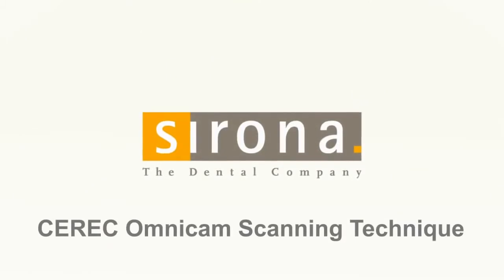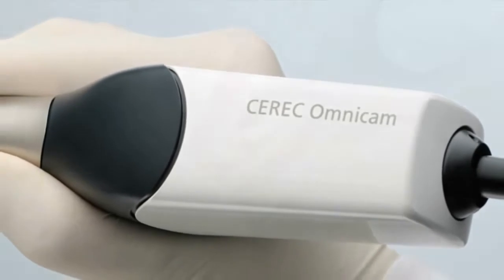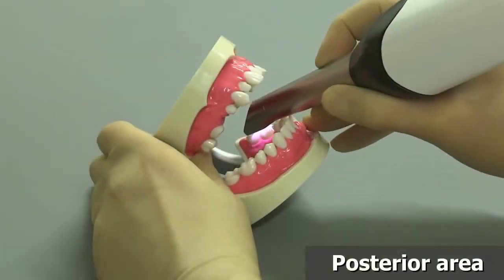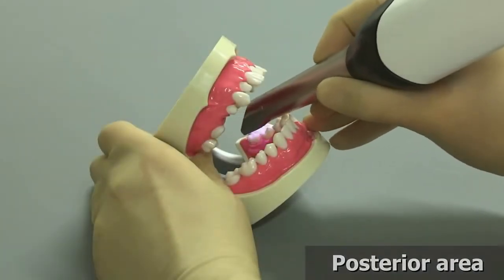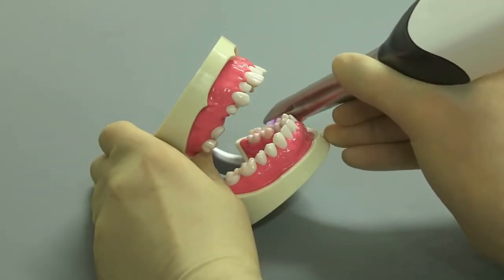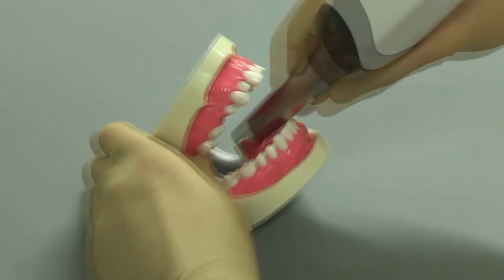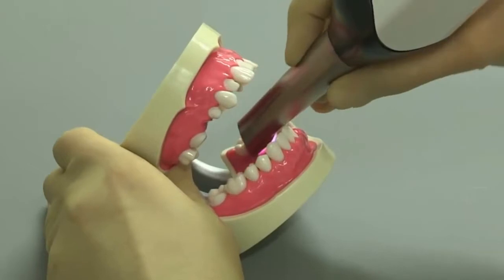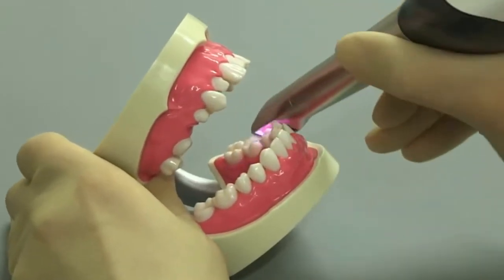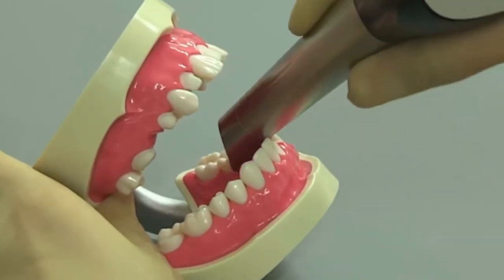We would like to demonstrate the best scanning technique for the CEREC Omnicam. You start in the occlusal view in order to scan the premolars and the molars. Move the camera in a fluid motion across the teeth. The camera does not rest on the teeth or gingiva during this procedure. Rotate the camera from occlusal to buccal and from buccal to lingual.